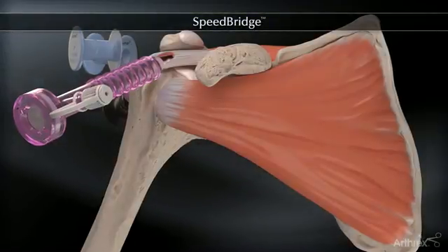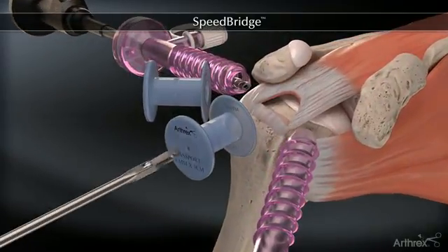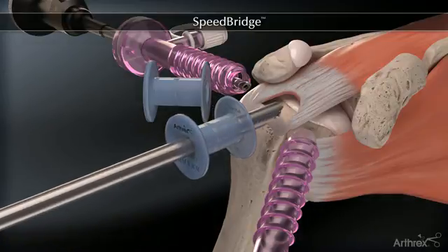The Arthrex SpeedBridge is a knotless double row rotator cuff repair that combines fully threaded swivel lock anchors with fiber tape to create a strong and low profile construct while minimizing surgical steps.